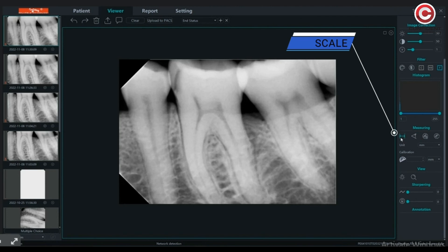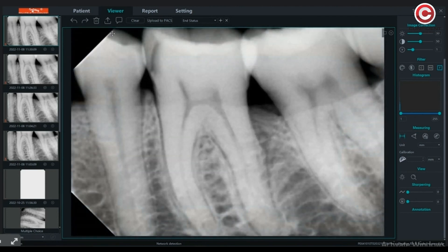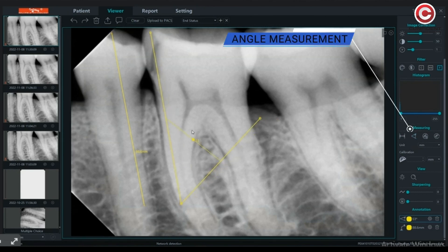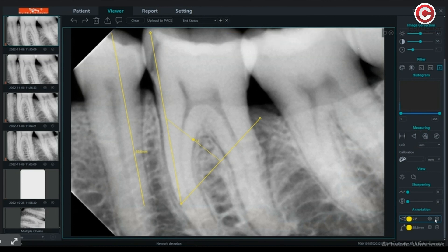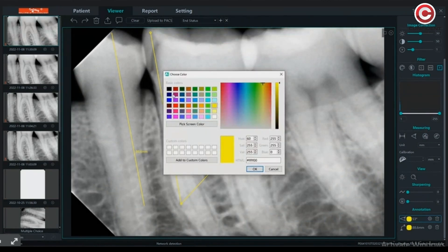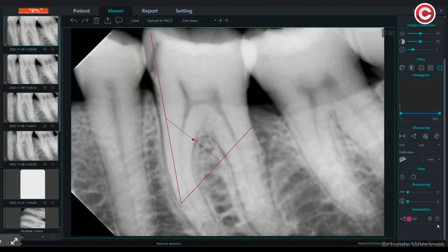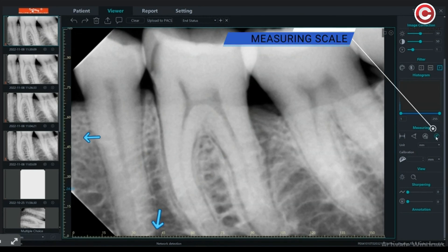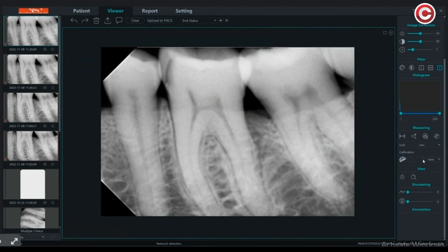For measuring distance, you have a scale option where you can select the measuring unit. You can also measure the angle using the angle tool. Use the annotation tool to change the color of lines by selecting the one you want to change. You will also find the delete option here. When you press on this icon, a measuring scale will appear — select the unit for calibration here.